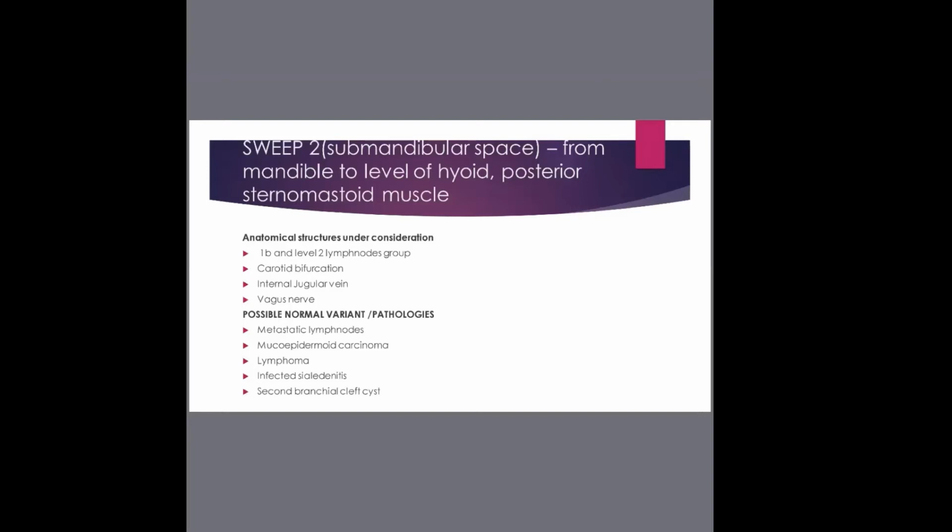And that tongue lesion, at the end of the day, when the patient had a CT scan, was really an aggressive sort of lesion. So if I had focused on the lump at the back, who knows, maybe in the next 6 months that patient would be gone because nothing was picked up. You're not doing this for credit. Even if I didn't do that, nobody's going to come back and say, why didn't you scan? Because the request was the lump at the back of the neck, yeah?